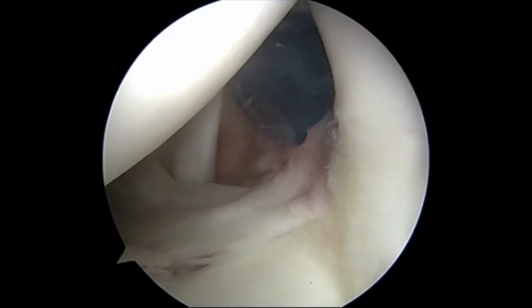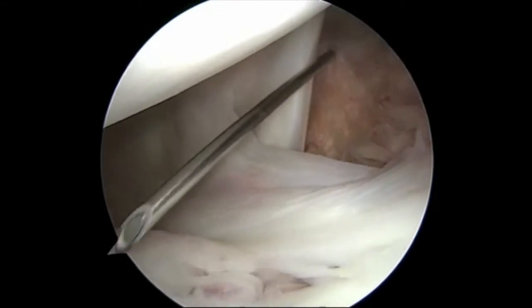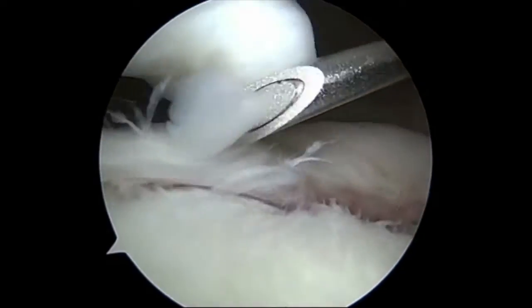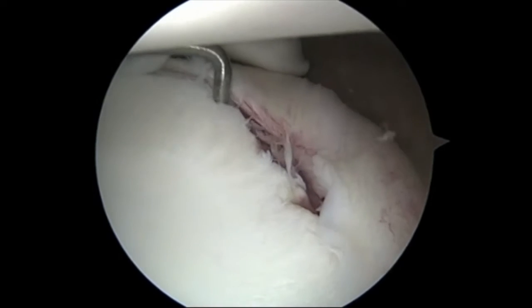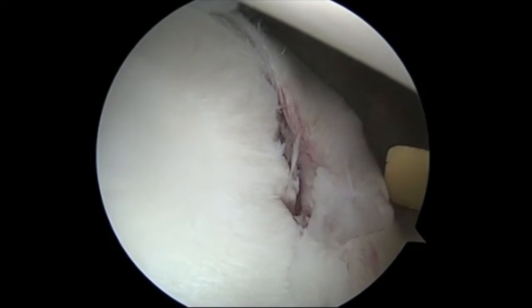This is a left shoulder viewed from the back. The spinal needle comes in and you can see the tear in the labrum as it's separated away from that white socket. We also see a loose piece floating around.